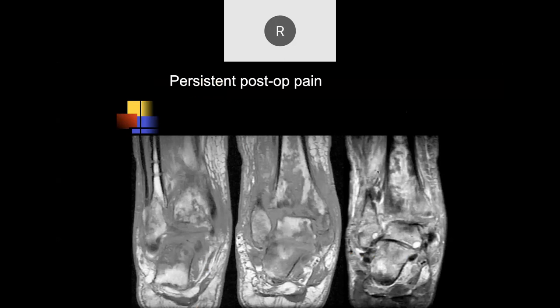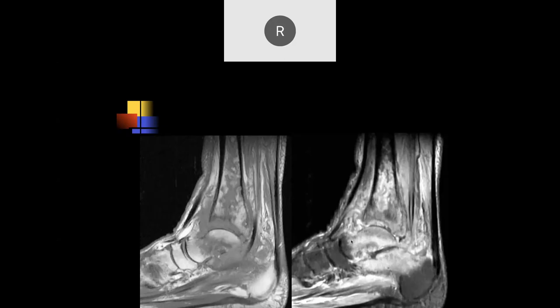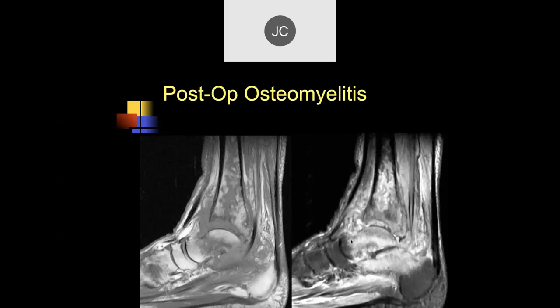A patient with persistent post-operative pain. There's irregular signal throughout the bones, a lot of destructive change, effusion and fluid collections, and looks like some hardware has been removed — concerning for post-op infection. This was a fracture, they put in internal fixation, it got infected, they had to remove it and treat the infection, then hope to salvage something after the infection is completely treated. This is what we call iatrogenic infection.